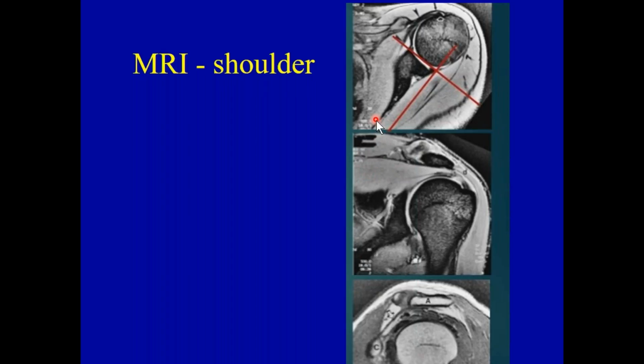We can see the subscapularis muscle. In other words, we can see white densities, we can see gray densities, we can see black densities, and we can see a lot more anatomy. So the beauty of the MRI examination is that it is best for seeing anatomy that we talked about, if you took your chiropractic assistance program. We talked about it in radiology.